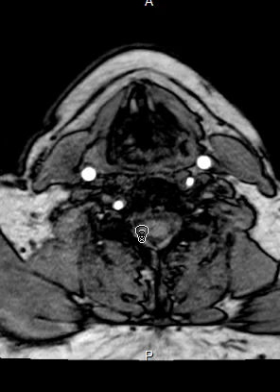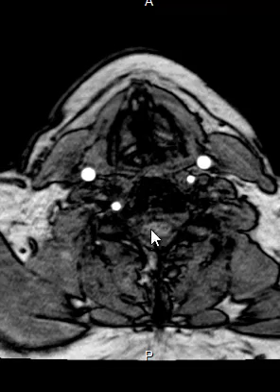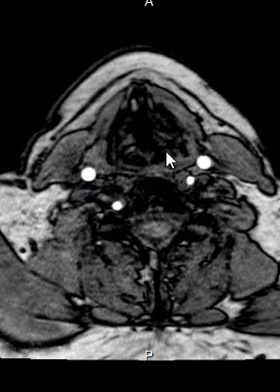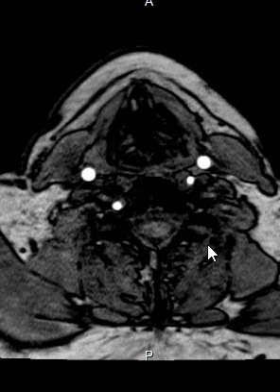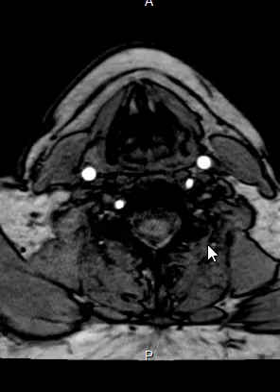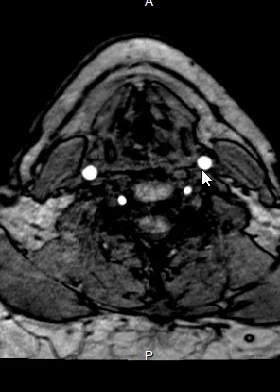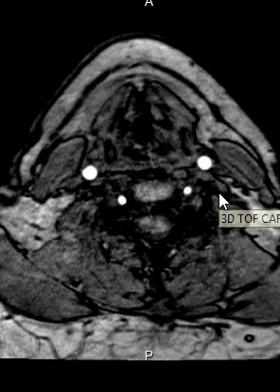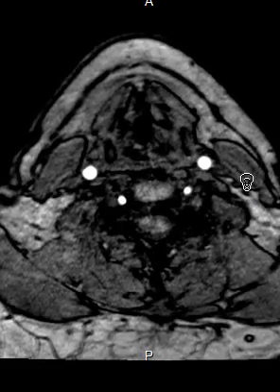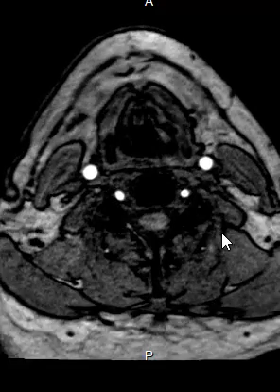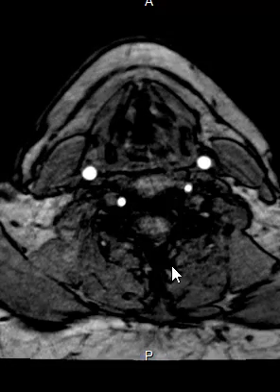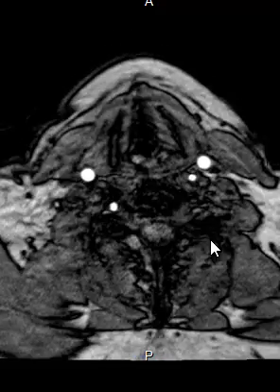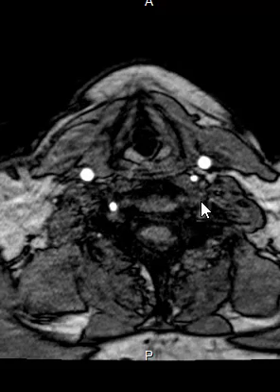On these images we can see blood vessels as very bright. These little round things here are the blood vessels with flowing blood being very bright. If your blood is not flowing, or if there's a little area in the middle like a stenosis, some atherosclerotic plaque, or a dissection, it'll show up as dark. These are the raw images we start with, just like any MRI scan.